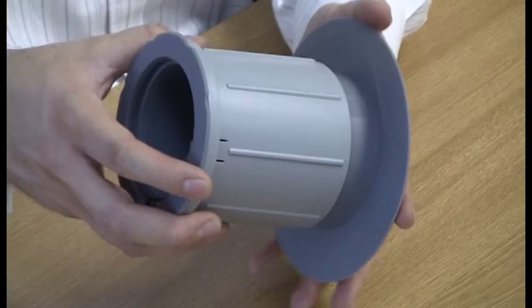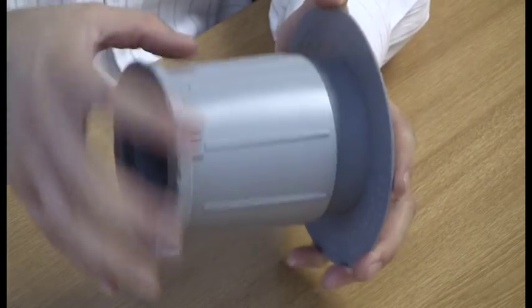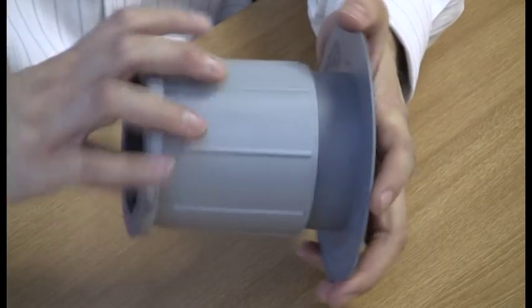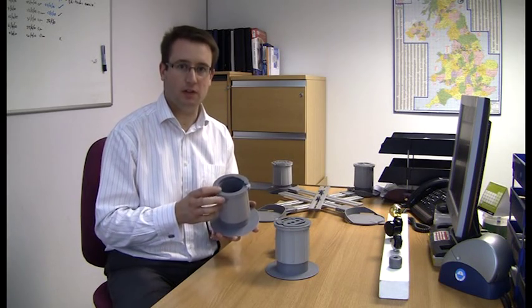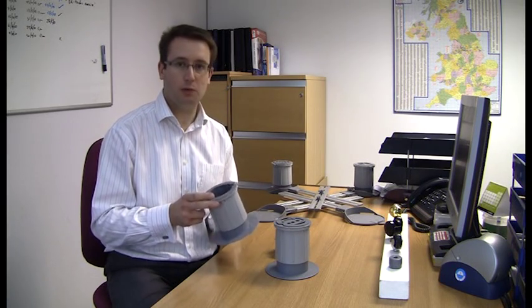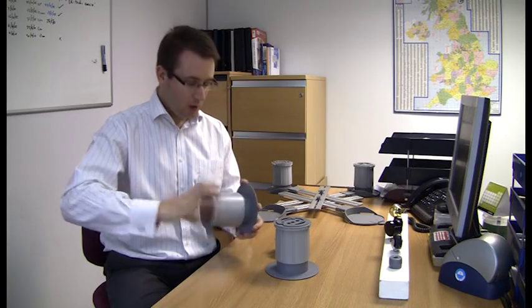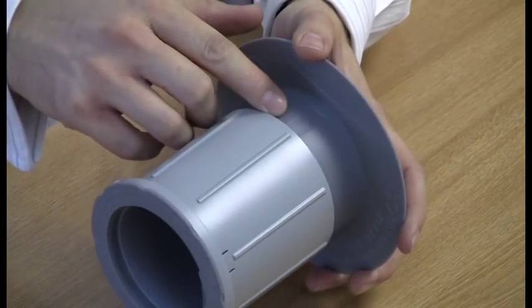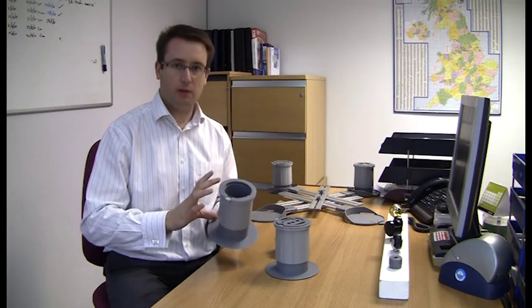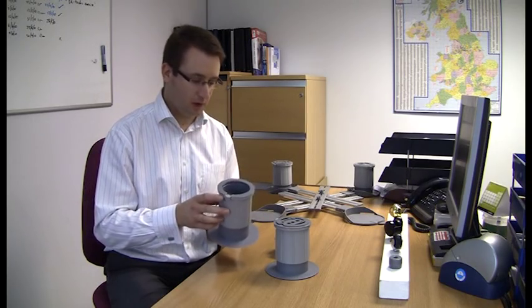The raisers are adjustable in height simply by turning the body of the raiser relative to the base. It's on a screw thread and can be adjusted for furniture with legs between two and five inches, or for furniture with casters between four and seven inches. When you adjust the height, there's a gauge on the side to ensure that you can get all the raisers the same height and give you an approximation of how high you're raising the piece of furniture.